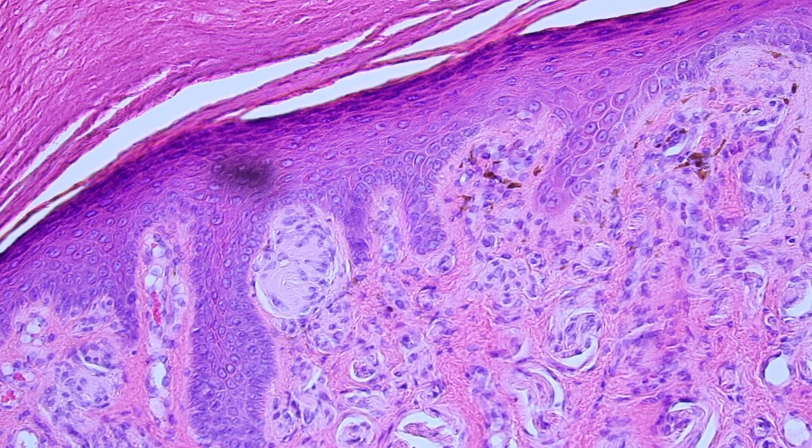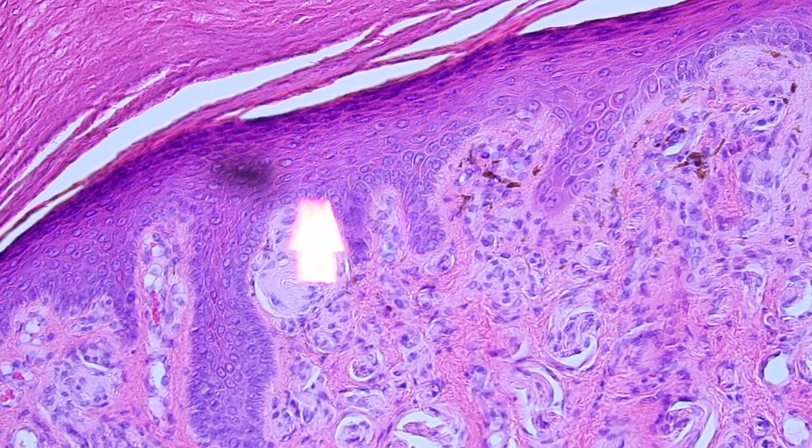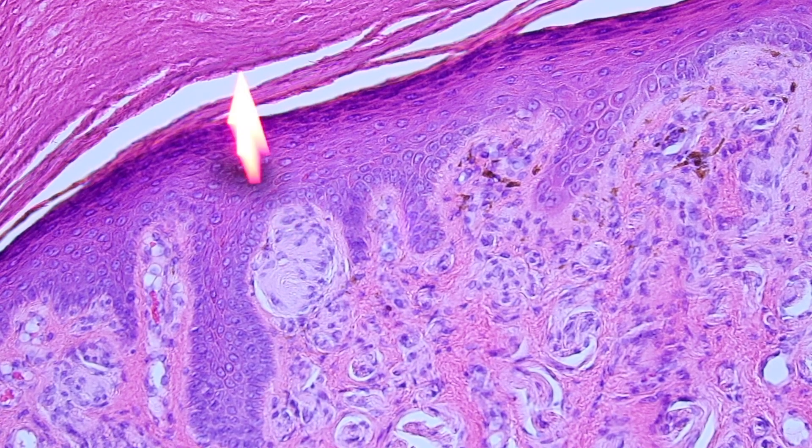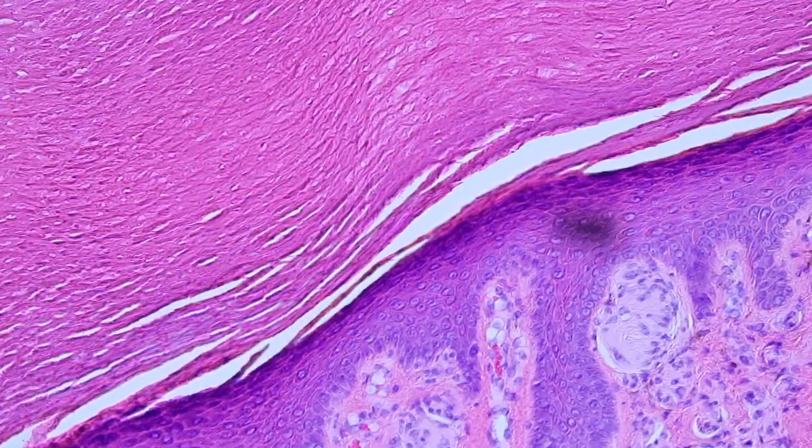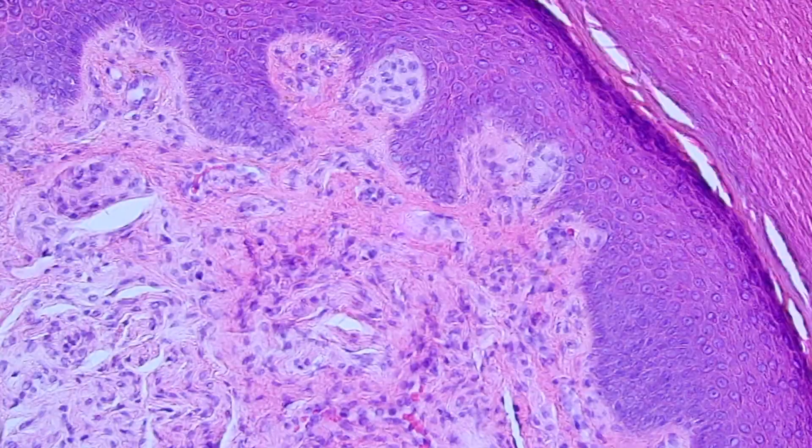These are fine touch receptors. You pretty much only see them on the volar — the palmar or plantar surface of acral skin — because they're for fine touch. That's why they're right up underneath the epidermis, so that they can feel the finest little touches. That's why your fingers have fine touch receptors.